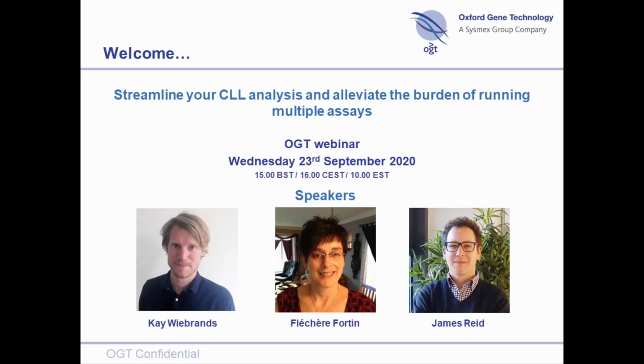Kai, can the panel, this is actually linked to that first part of the question, can the panel detect IGHV hypermutation? So yeah, we do appreciate this region is of great importance for CLL, but this panel does not target the IGHV region, so does not detect IGHV hypermutations. So I would say this is definitely a region of interest to us. But at the moment, we don't offer a solution for capturing IGHV hypermutations.